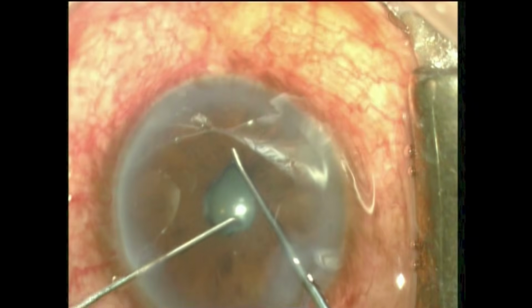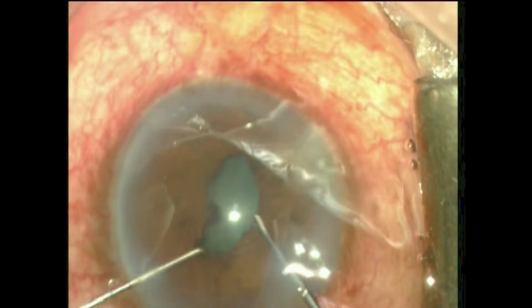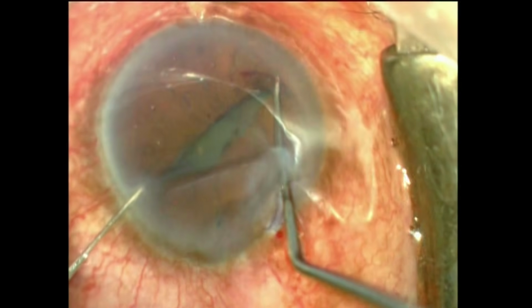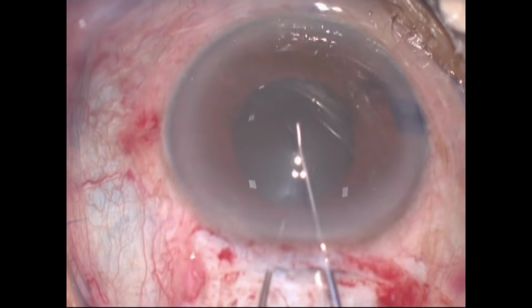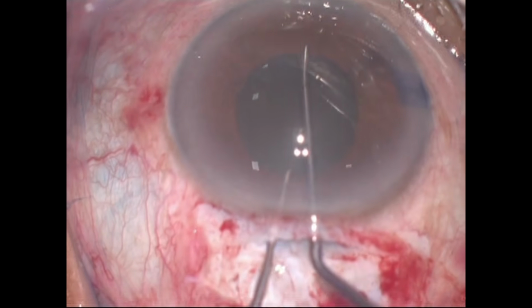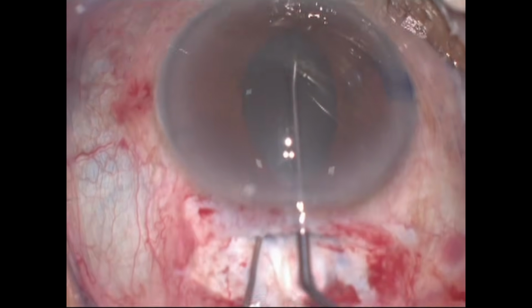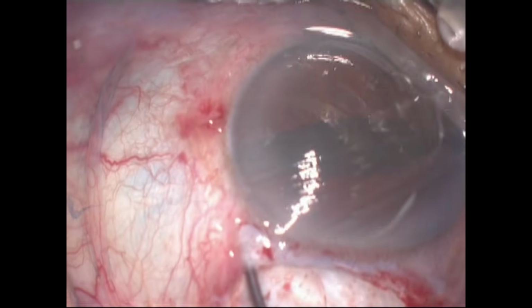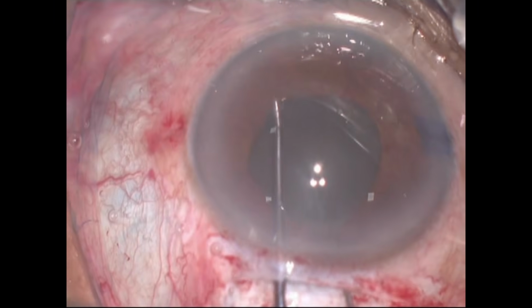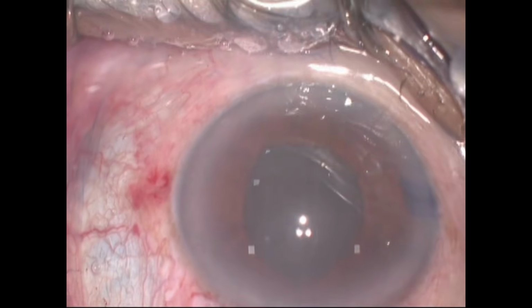Here we are doing the pupil stretch with the help of 2 wire rods introduced through the paracentesis incisions located contralateral to each other. The main idea of this maneuver is to stretch the pupil in vertical and horizontal meridians to create small sphincter tears in the fibrotic iris tissue and to expand the pupil. Although it is simple and effective, this manipulation may not provide sufficient mydriasis. It can cause iris bleeding and pupil atony postoperatively.